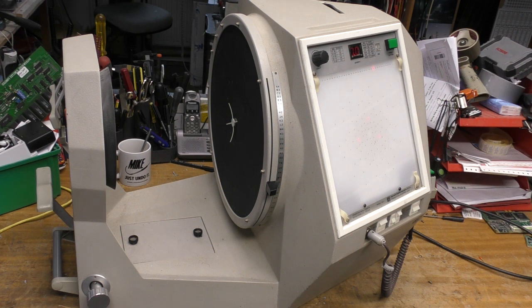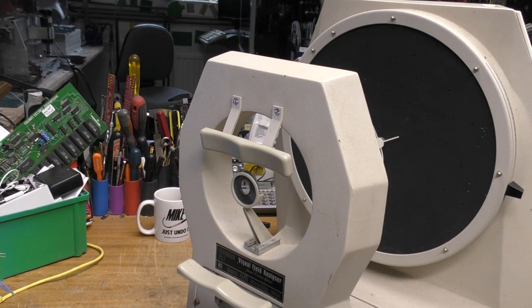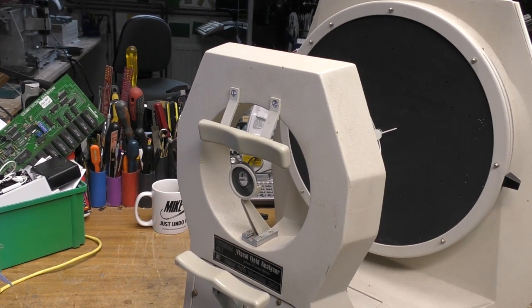And this is an instrument used by opticians, ophthalmologists, eye doctor people to analyse somebody's field of view, i.e. if there's any variation in sensitivity across the field of view of the eye. It does that by flashing some lights at specific positions and specific intensities to see whether there's any variation in vision across the field of view. This dates from the early 80s, so there's probably going to be some good old style discrete through-hole electronics in there.